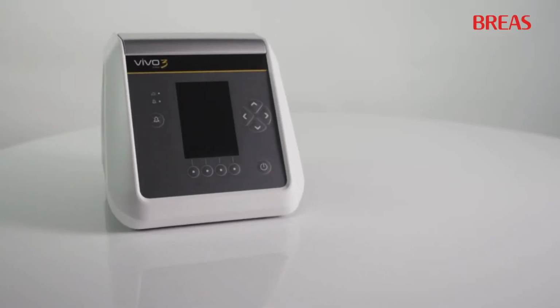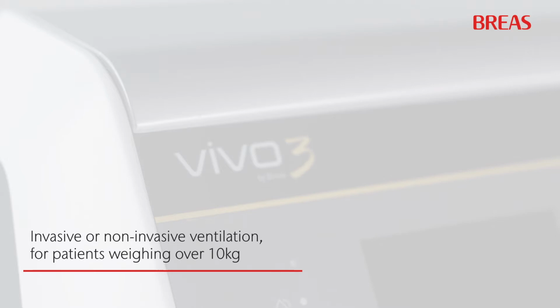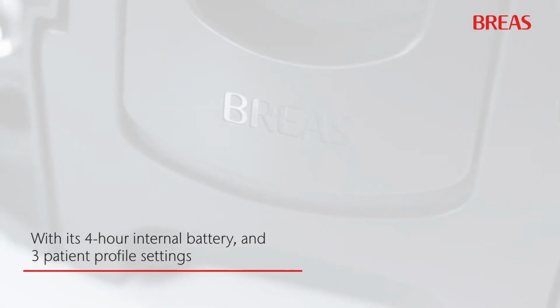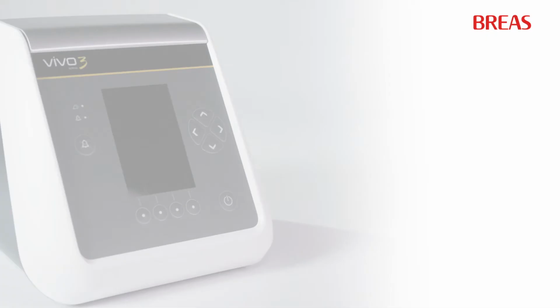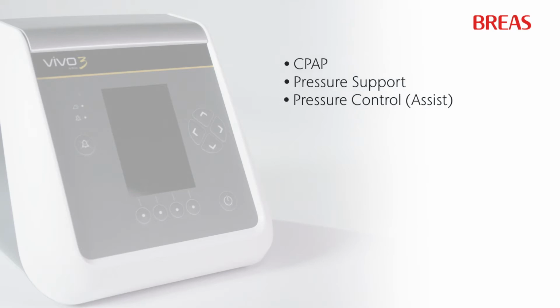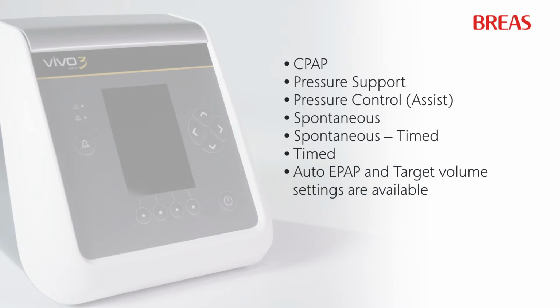The Vivo 3 by Breas is intended for invasive or non-invasive ventilation for patients weighing over 10 kilograms. With its 4-hour internal battery and 3 patient profile settings, it can be used in a variety of ventilation modes. CPAP, pressure support, pressure control, spontaneous, spontaneous timed, timed, and auto EPAP and target volume settings are available.